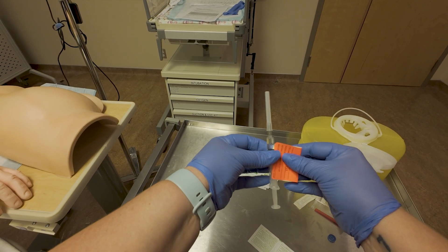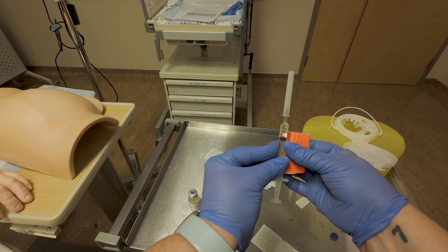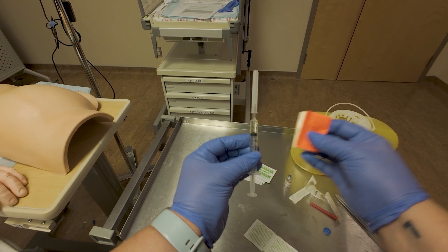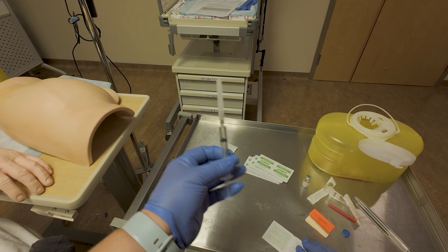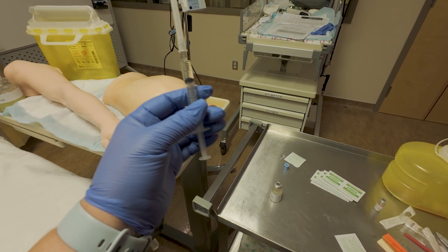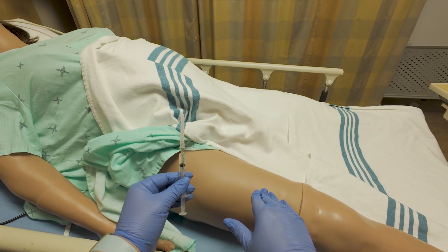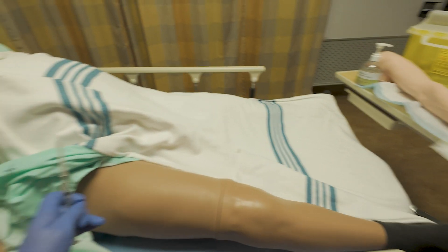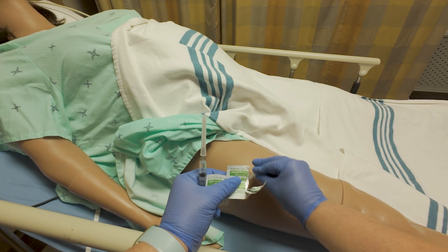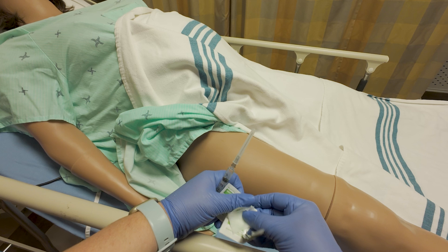We're going to label the syringe — sticking the label so that you can see the amount of medication in the syringe. Now to administer our oxytocin, we take our syringe with our medication, identify our correct patient, and clean the patient's skin with an alcohol prep wipe for 30 seconds in a circular motion, and we're going to let that dry.